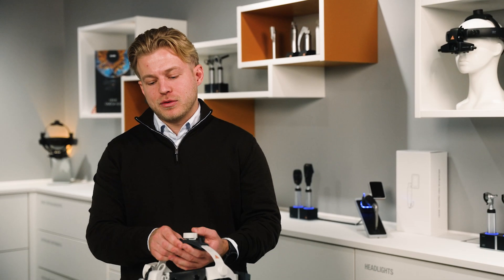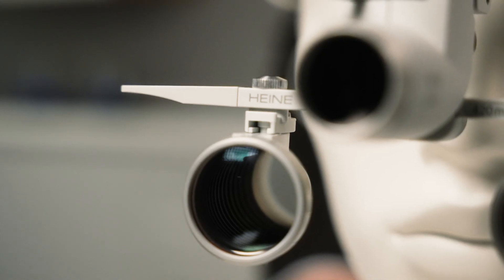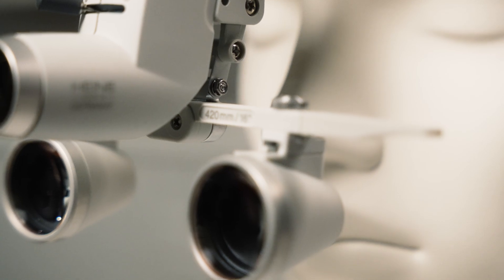We will show you how to set up the Heine ML4 LED headlight with the binocular loops. One of the big advantages of the ML4 is that you can adjust both the headlight as well as the loops for your perfect personal fit. In this video we're going to show you how to adjust both the headlight as well as the loops to obtain the perfect field of view.